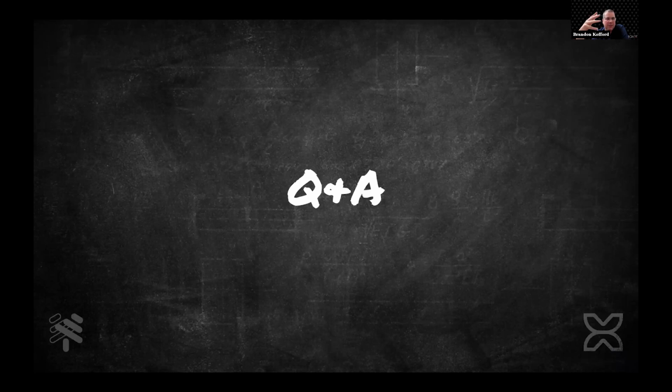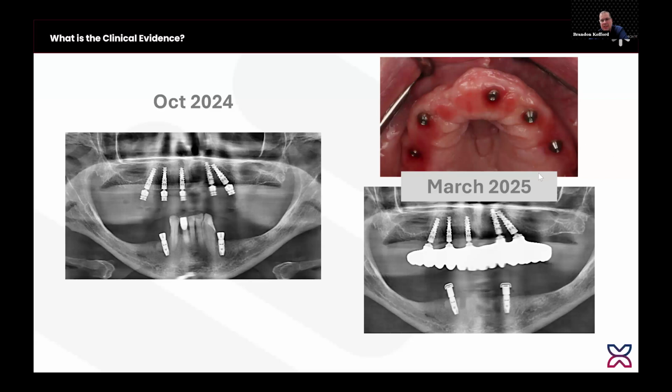You think about tissue as a fluid-filled sac. It just flops into the space. We have this image where you can see the soft tissue around that abutment. A lot of this comes to surgical technique, making sure that you maintain good keratinized tissue around the abutments. And then you get this really nice seal of soft tissue around the abutments.